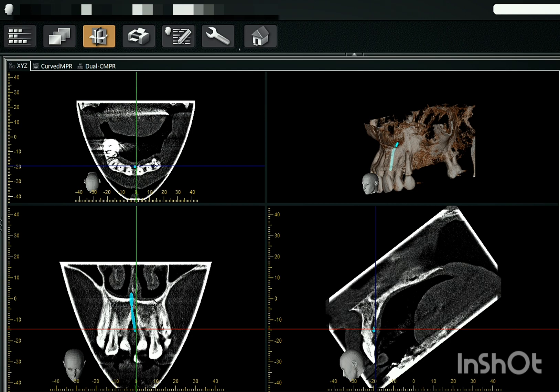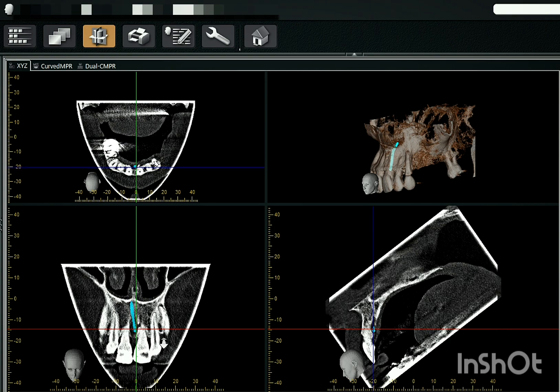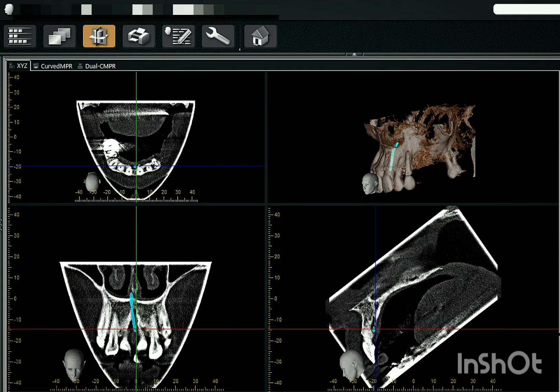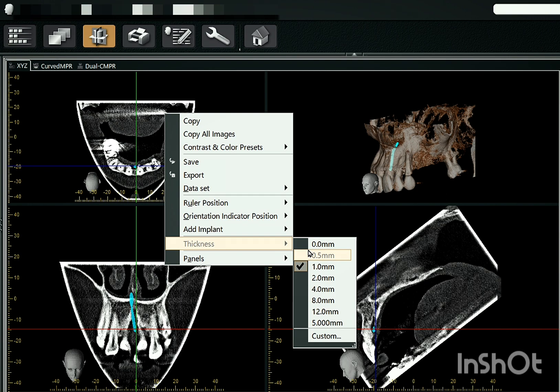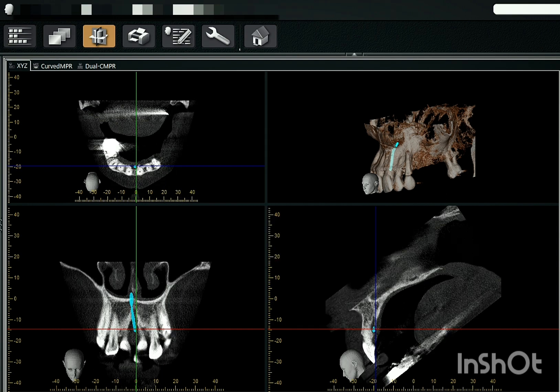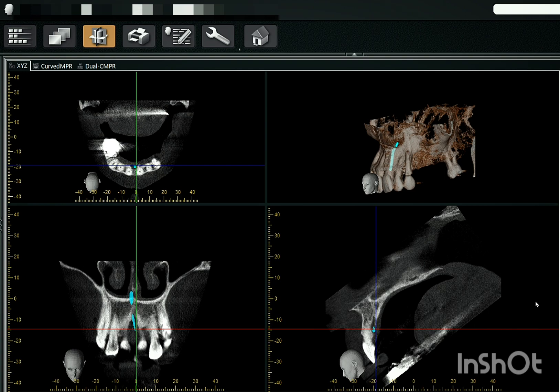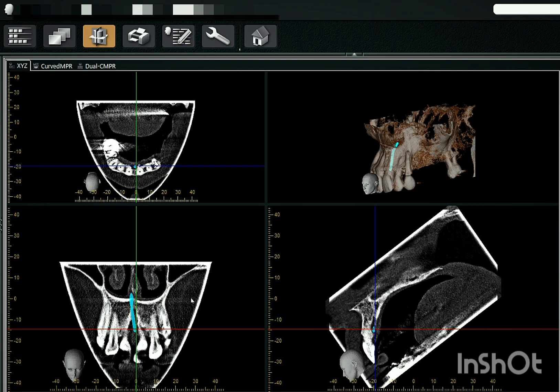You can just see this line which is there. Besides the nasopalatine nerve canal, this line which is passing by radiolucent line. So that is your nerve canal. If you want, you can just decrease the thickness of this, sorry, sharpness of this. I've just reduced the sharpness, but the visibility is also reduced.